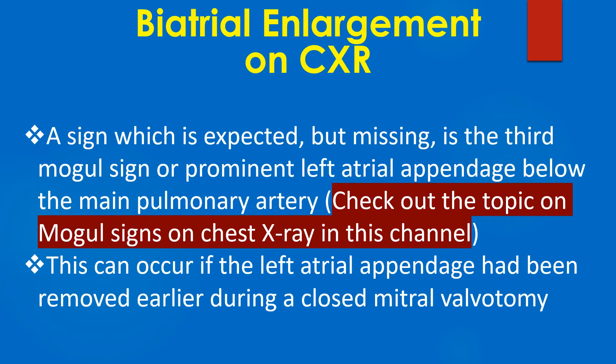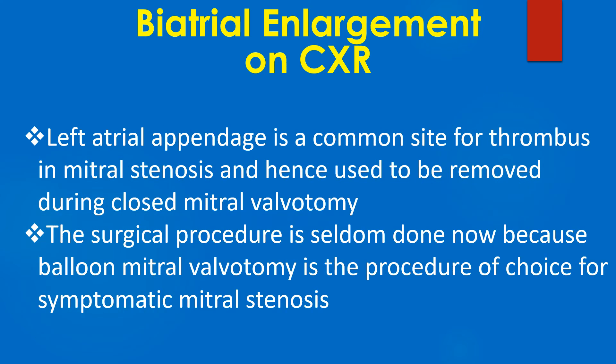A sign which is expected but missing is the third mogul sign, or prominent left atrial appendage below the main pulmonary artery. This can occur if the left atrial appendage had been removed earlier during a closed mitral valvotomy. The left atrial appendage is a common site for thrombus in mitral stenosis and hence used to be removed during closed mitral valvotomy.